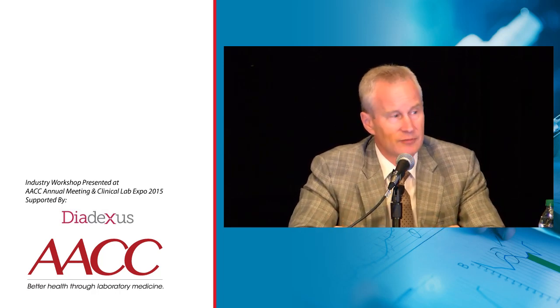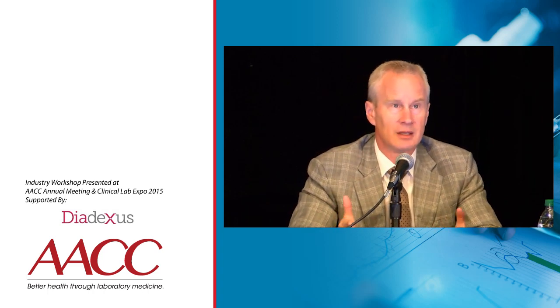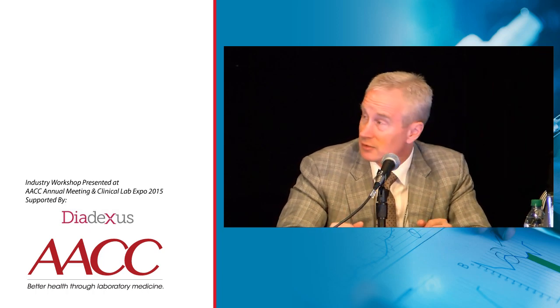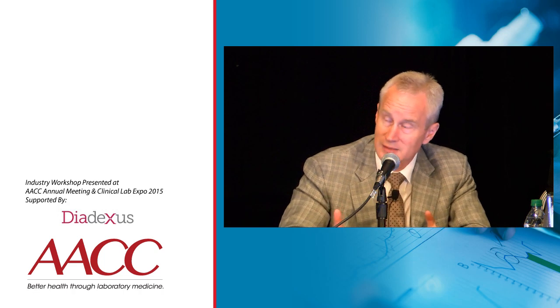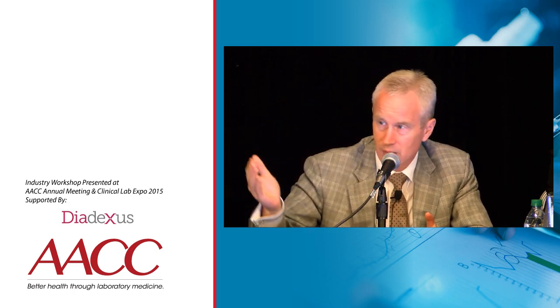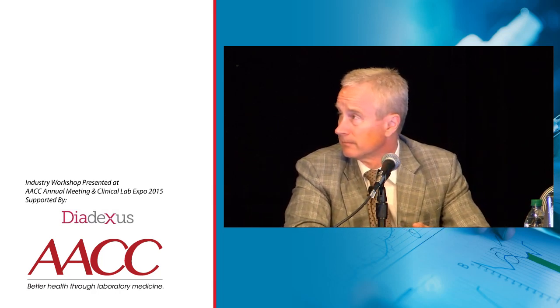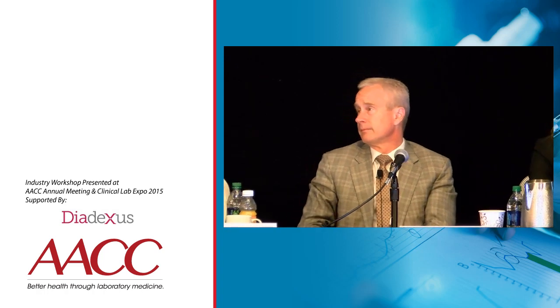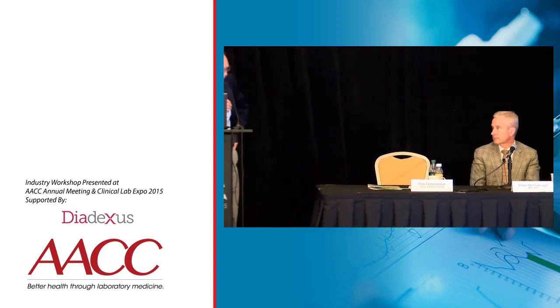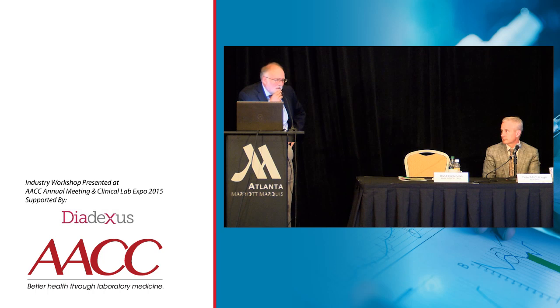I think there's a lot of precision, and I'm excited to move on. I think Ken's convinced me, and Leslie has as well, that the new test is a better test. It's a better test, and in your hands now, I think it's going to be much more available and interpretable across hospitals and centers worldwide. Yeah, and it's interesting, as I listened and learned from the discussion today, certainly activity would be much closer to function than is a concentration or a mass assay.